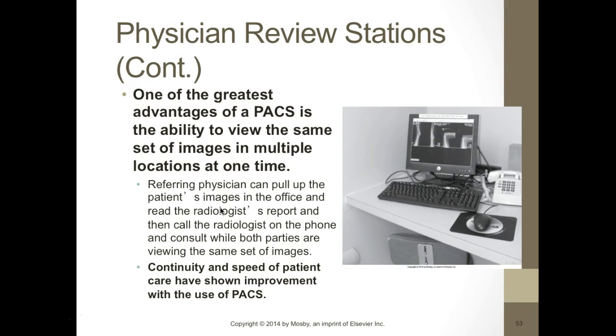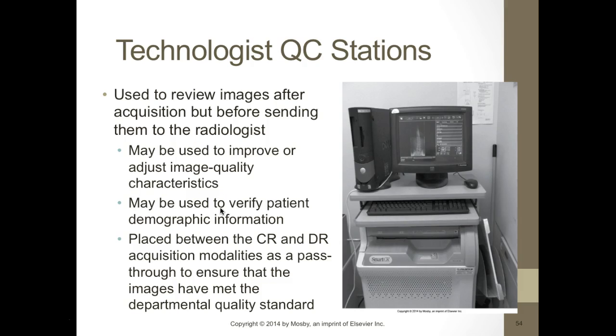The referring physician can pull up the patient's images in the office, which is really cool, and they can look at the report, and they can call the radiologist, and they can consult at the same time while both of them are looking at the images, which is great.